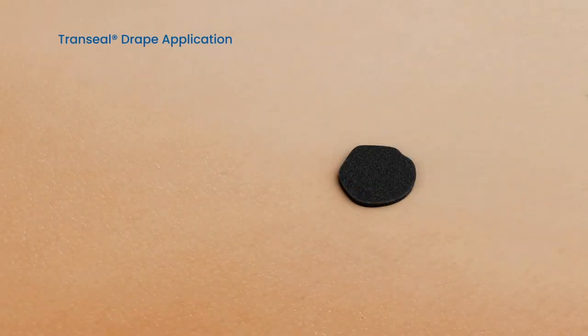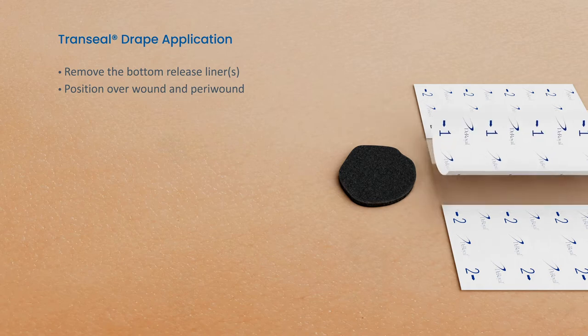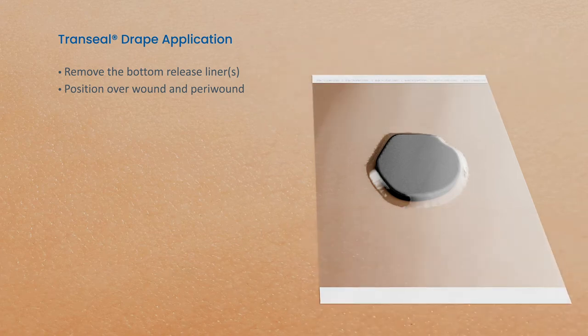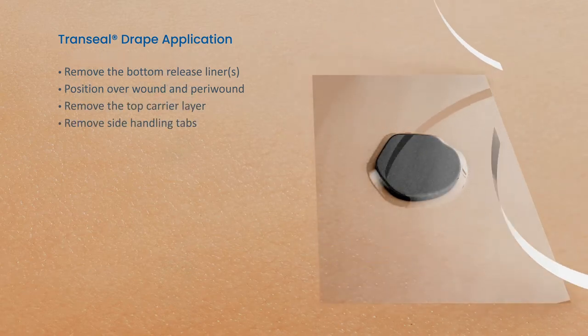Next, cut the trans-sealed drape to cover the wound with at least 5 cm of peri-wound overlap. Apply the trans-sealed drape by removing the bottom release liner labeled 1 and affixing to the wound area. Pull release liner 2 and secure the dressing. Holding onto the handling tab, remove the carrier layer 3. Gently tear off the handling tabs.